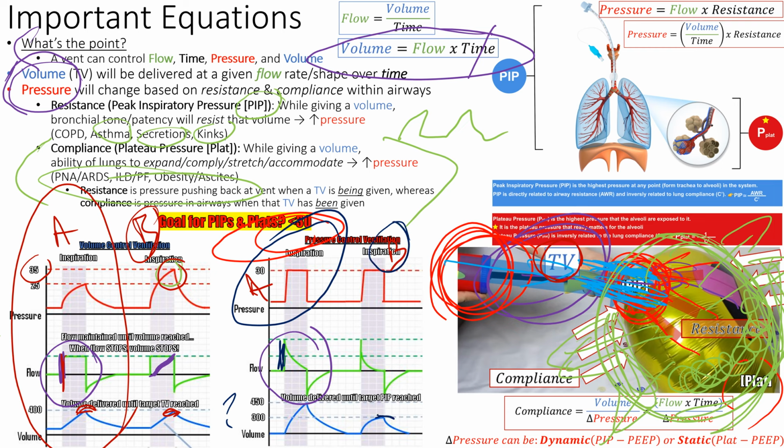Look how much they got. They got 300 cc's. We said keep giving air, keep giving volume, right? We're gonna crank the flow all the way up until you hit this pressure, right? We say go to a pressure control ventilation of 30. Don't go any higher than 30, right? And it's not a set it and forget it mode because you have to be alert to the volumes all the time because the volumes could be going down when you set them flat and they're obese or they're pregnant or they are doing a bed bath and they're turned to the side and they're coughing. That's going to cause low volumes.